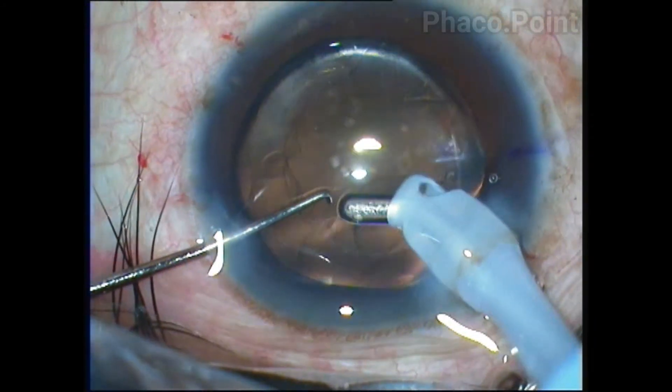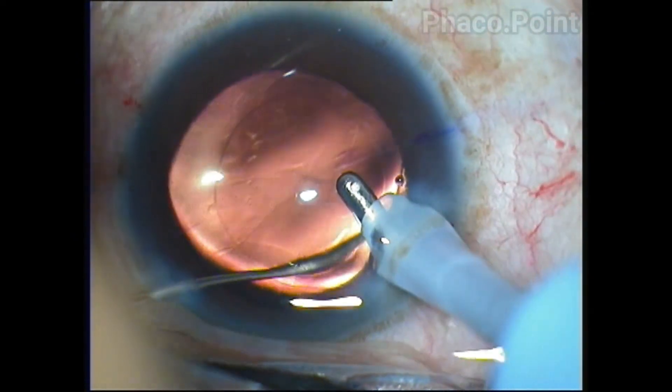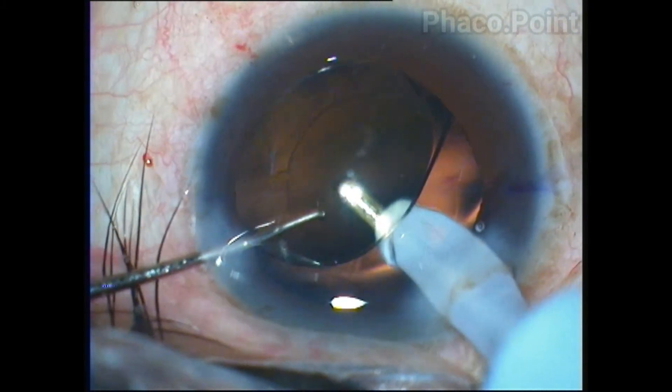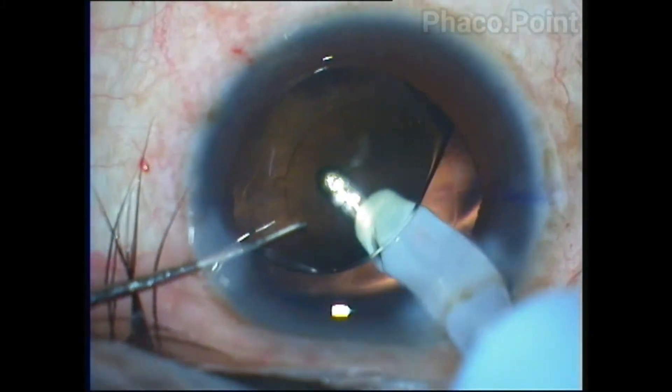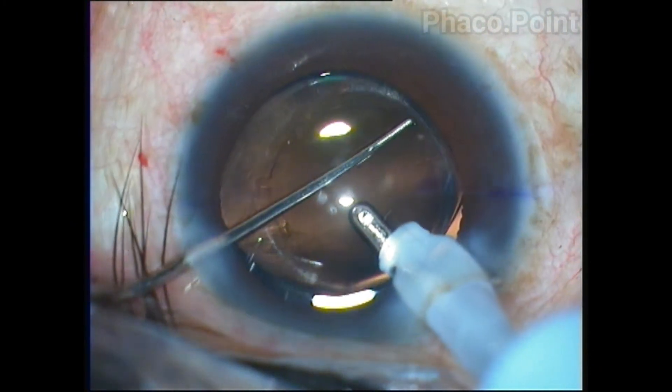At this point, the viscoelastic is washed out not only from in front of the lens but more importantly from behind the lens and from within the capsular bag. This step is important to prevent the lens from rotating within the capsular bag.